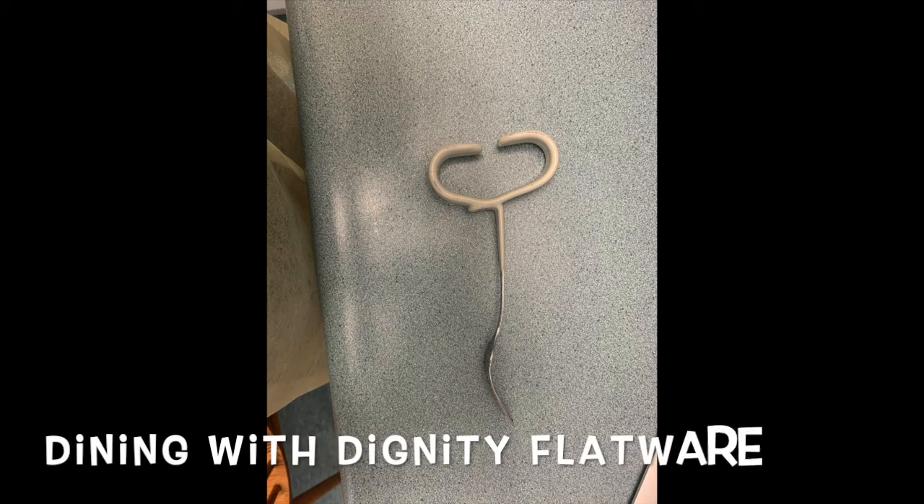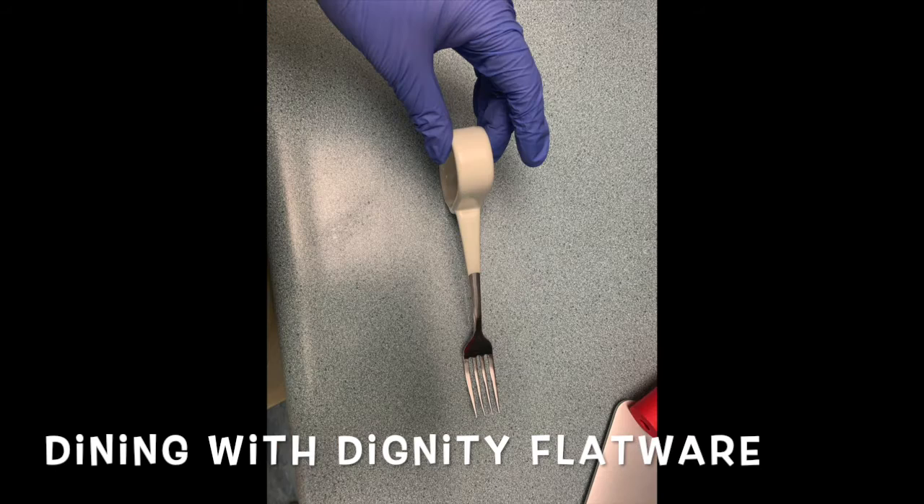The Dining with Dignity flatware has been developed specifically as attractive, functional assistive eating aids for grasp-impaired individuals. It enables those with grasp impairments to grasp their fork, knife, and spoon independently.